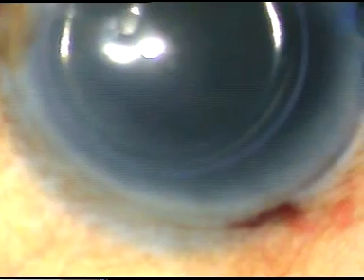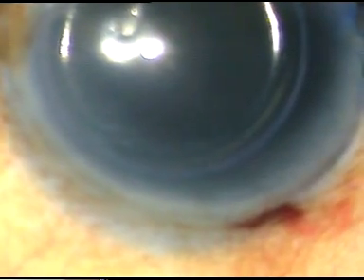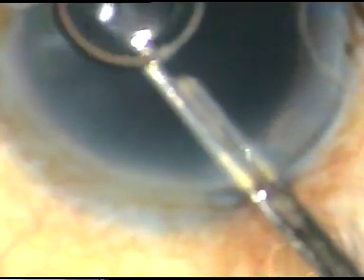I always stain the anterior capsule in black cataracts and brown cataracts with trypan blue dye, so that I can see the rhexis margin if necessary in later steps of surgery.